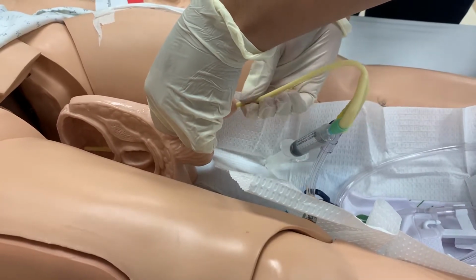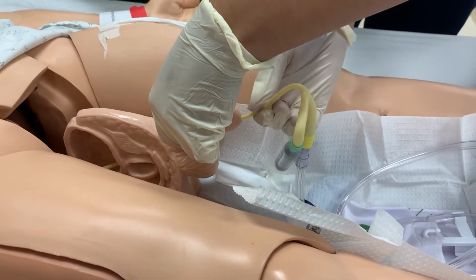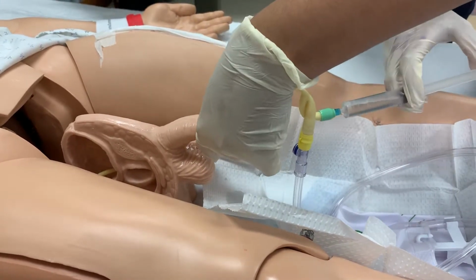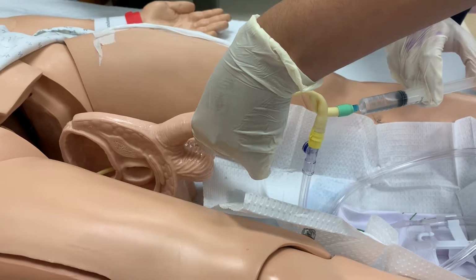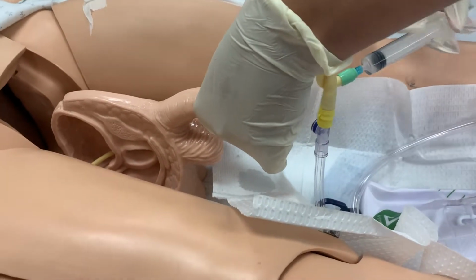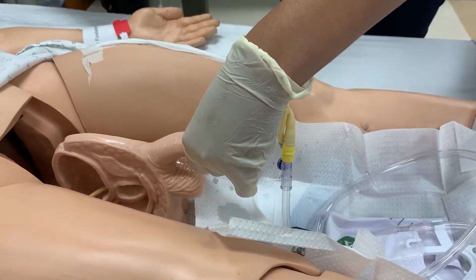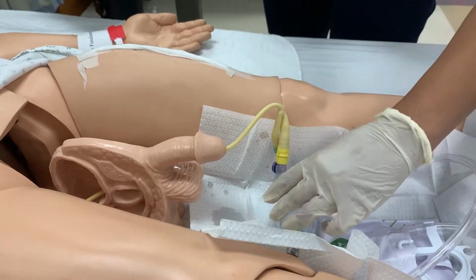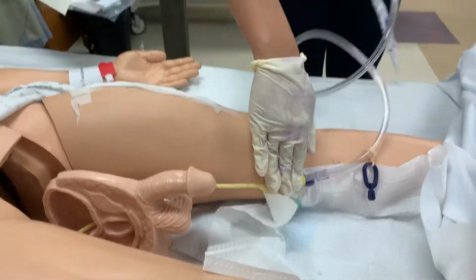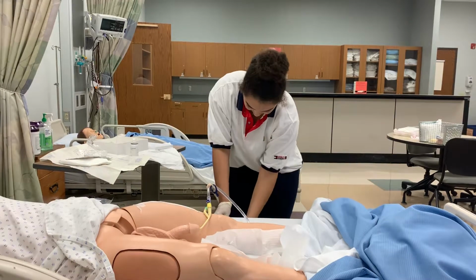And then you see urine? I see urine, and then you go in another 2 inches. And then I'm going to hold this with this hand and then inflate my balloon. Oh, it's inflated. All right, detach, discard, and then I'm going to clip this to his leg and hang my bag below bladder level.